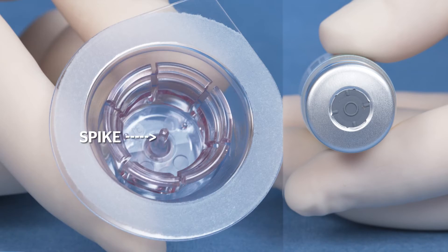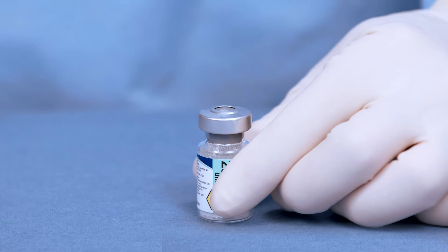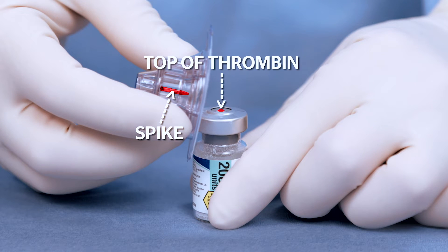In the next step, align the spike in the vial adapter to the center of the thrombin vial. Proper alignment is key to successfully spiking the vial. Align the vial adapter to the thrombin vial.